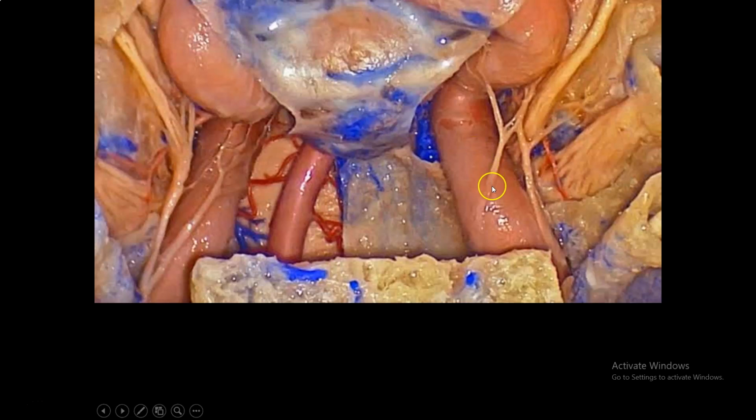We are showing more here, as we said, when you have the clivus, upper third of the clivus, lateral to it, carotid prominence, clival carotid, paraclival carotid, very dangerous. If you identify it and go lateral to it, you will find the Gasserian ganglion. So this is another secret. Where can you find the Gasserian ganglion from below? And lateral to it, of course, here you can find the floor of the middle fossa, and here you find the floor of the orbit. We'll see it now. This is the base for the extended transsphenoidal approach, as we'll see.